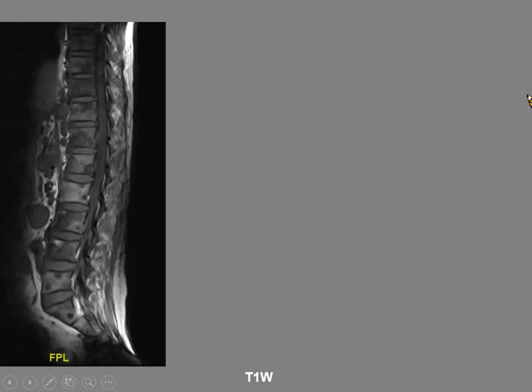And this is the classic appearance of a patient with a marrow infiltrative disease. You can see multiple lesions, varying shapes and sizes, randomly distributed throughout the skeleton. And when it has this classical appearance, the diagnosis is fairly obvious.